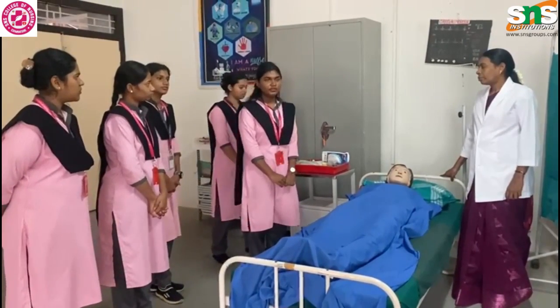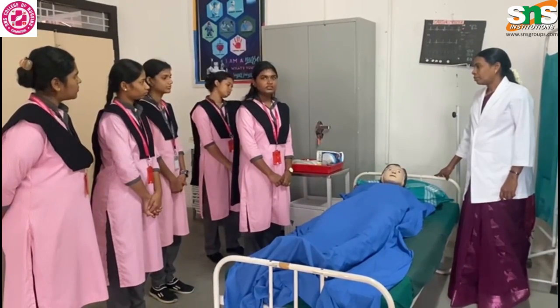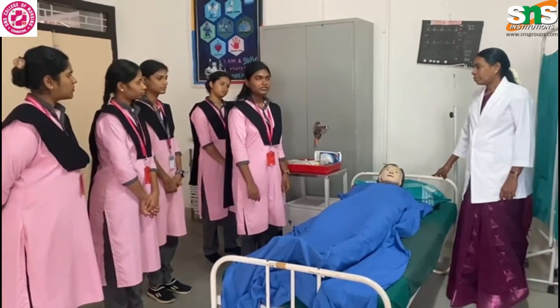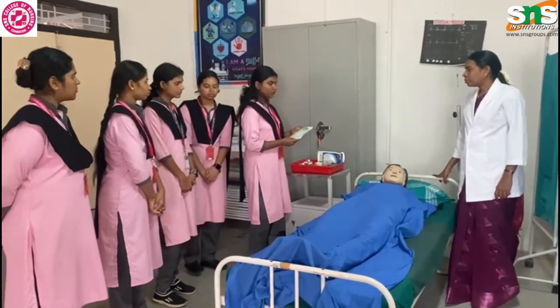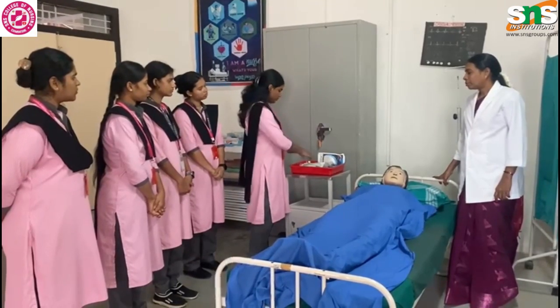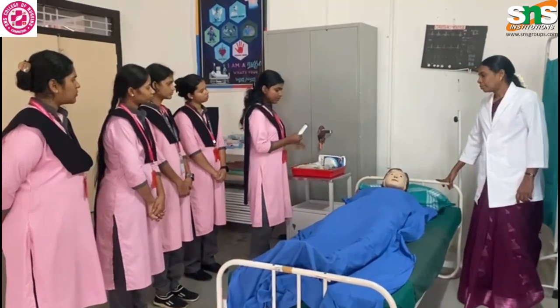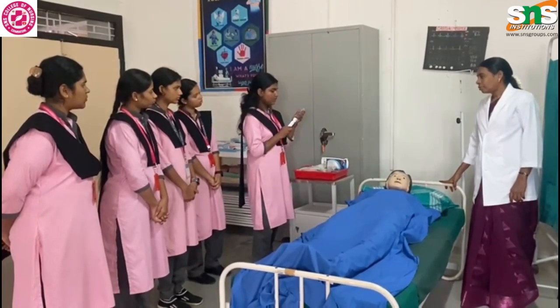Hello all, I am Frenubil. I am going to say the purpose of the NG tube feeding: lavage, gavage, decompression, compression and diagnostic studies. The articles required are an NG tube 16 to 18 French and a bottle of water to check the placement of the tube, and we have a 60 ml syringe to feed. We will only use the barrel of the 60 ml syringe.